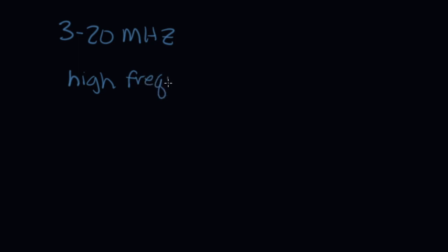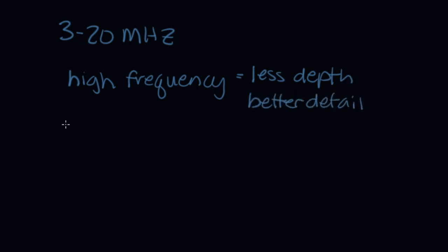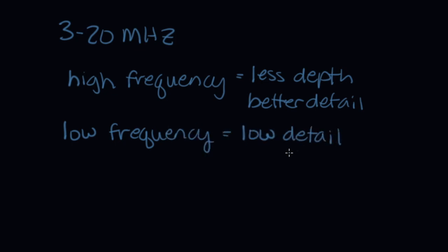High-frequency transducers have less depth but a better detail in the image generated, whereas low-frequency transducers have low detail and a high depth of penetration.